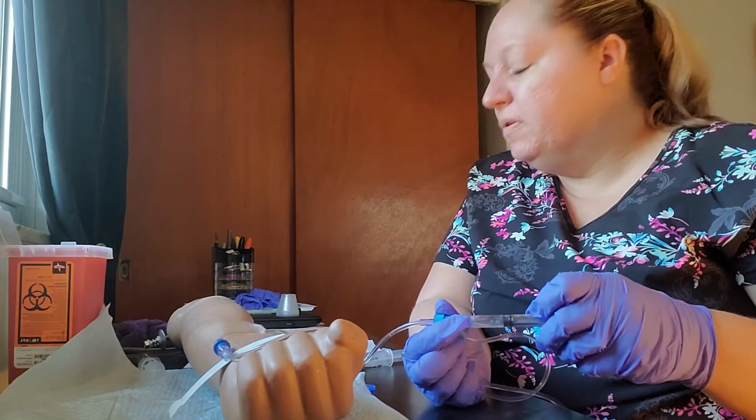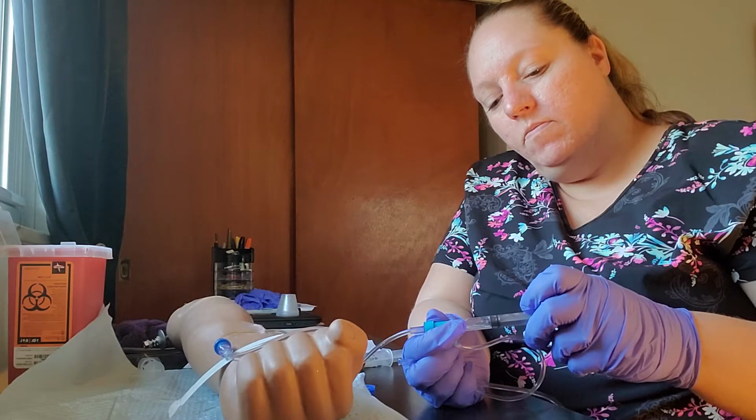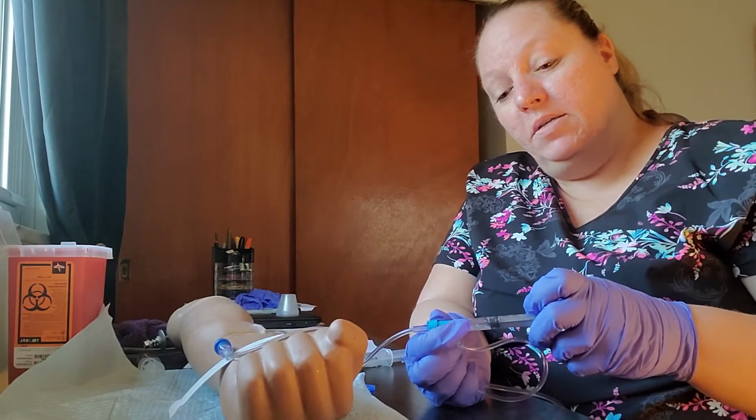Mary, let me know if you feel burning or any pain with this going in, okay? If you do, I'm going to stop it and I'm going to go notify my doctor.